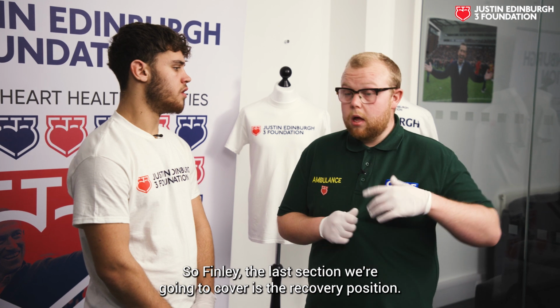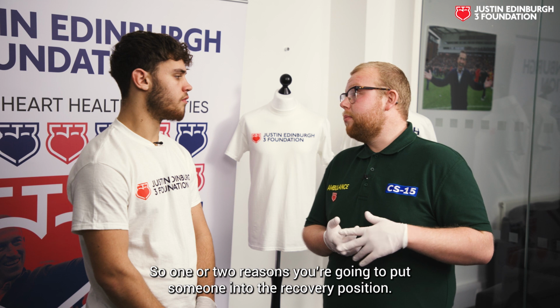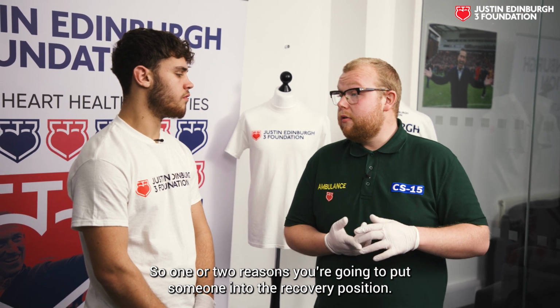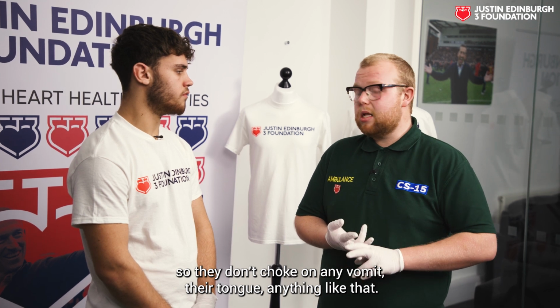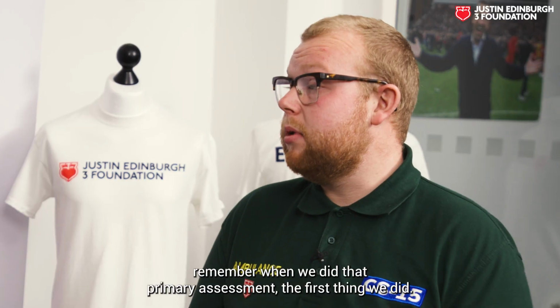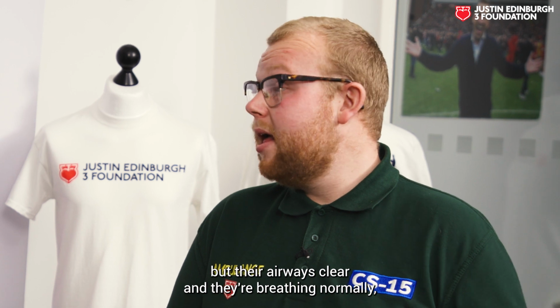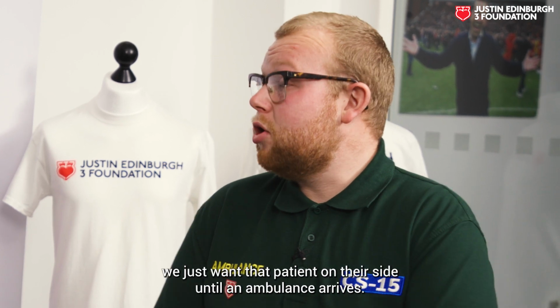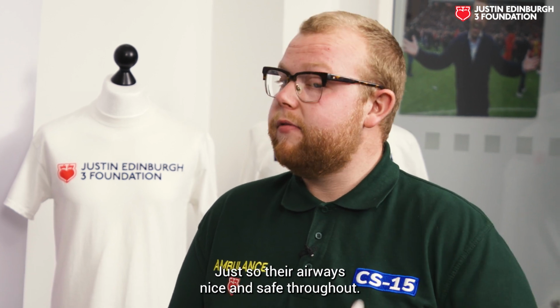So Finley, the last section we're going to cover is the recovery position. There are one or two reasons you're going to put someone into the recovery position. Either if we've successfully resuscitated them before an ambulance arrives, you're going to leave the pads on them, put them in the recovery position so they don't choke on any vomit, their tongue, anything like that. Or if they are breathing normally. Remember when we did that primary assessment, once you get down to response, if they're unresponsive but the airway's clear and they're breathing normally, we just want that patient on their side until an ambulance arrives, just so that airway is nice and safe throughout.